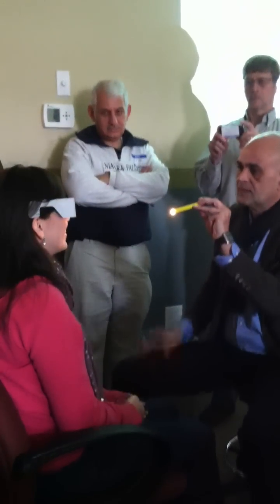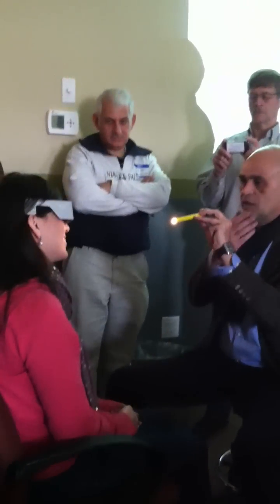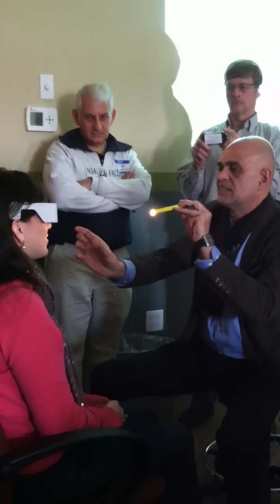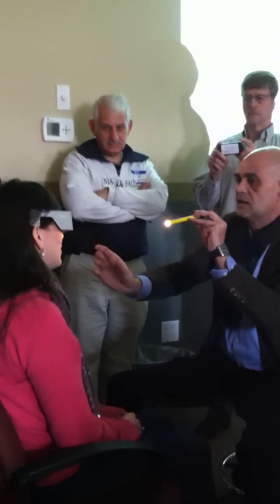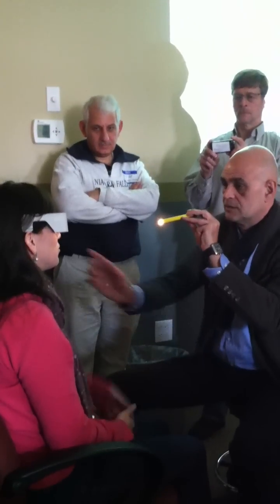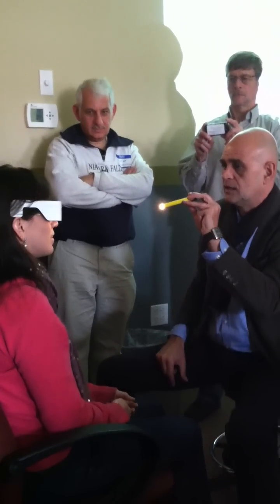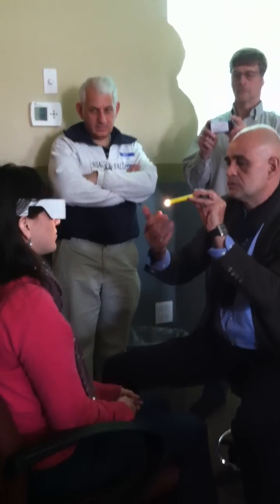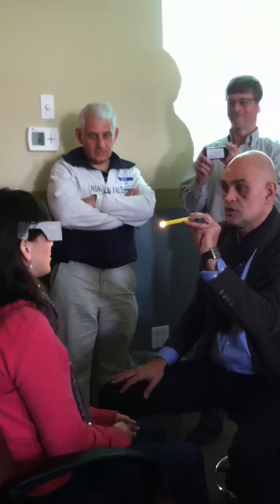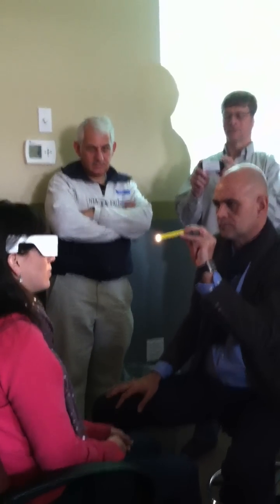Now you twist your head — you turn your head like this. And you turn in the other way. Very slowly. You move your chin. You rotate your head, so you turn your head and always look at the light. To the left, and to the right. And now you go the other way and come back. What happens to the lines? Are they equally long? So then you move again and just look at the lines — equally long or not?